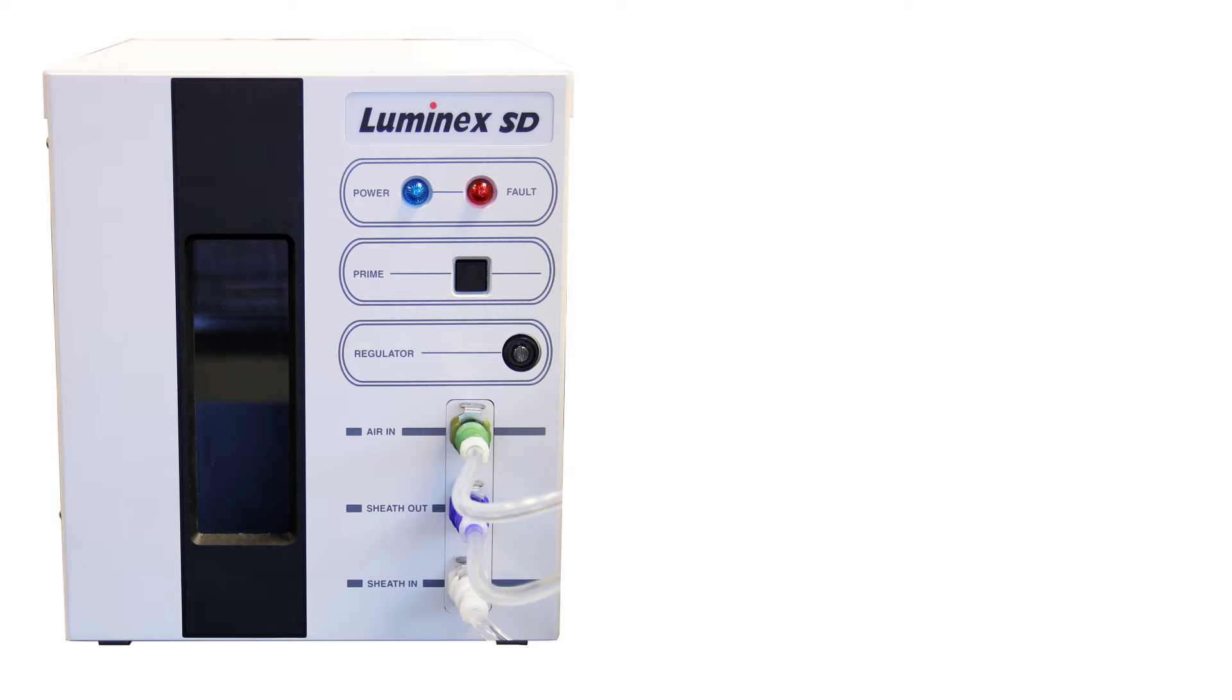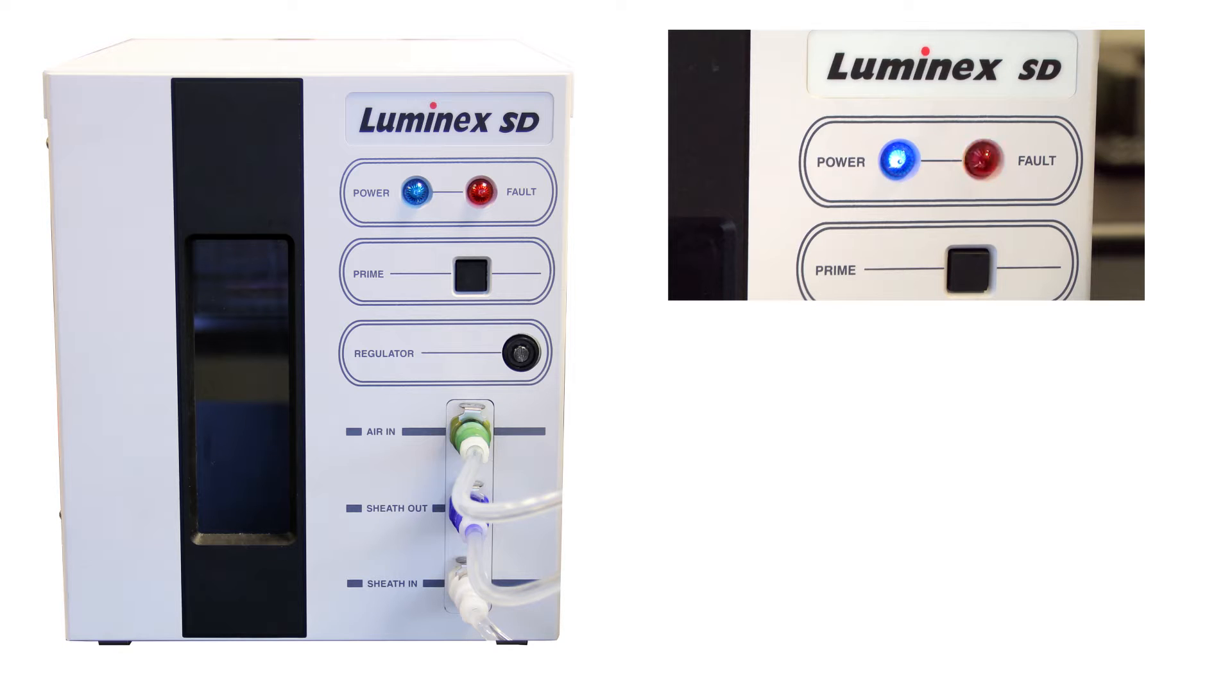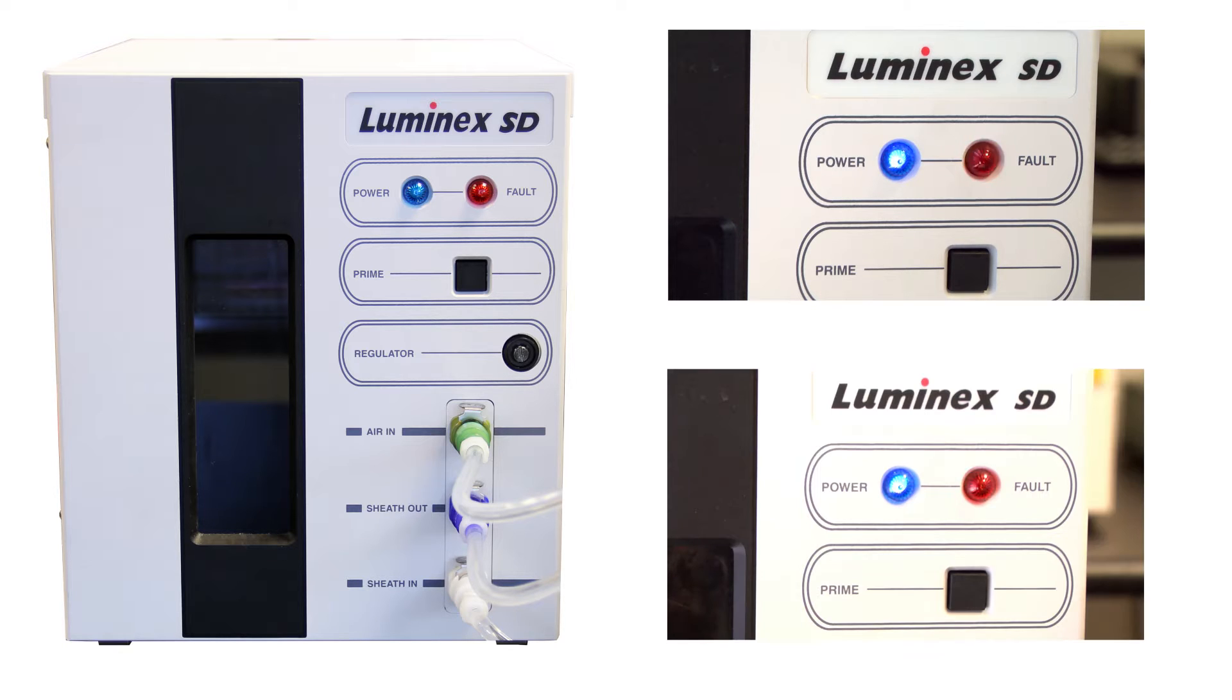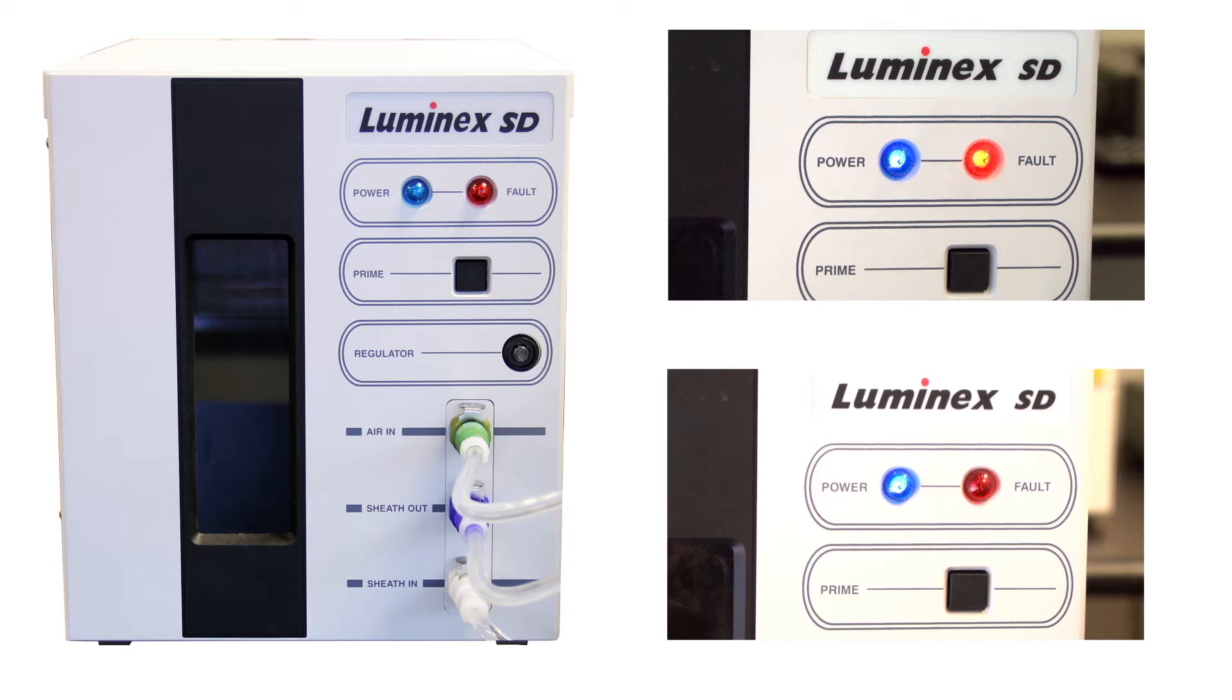The Luminix Sheath Delivery System has an audible alarm that sounds to indicate an issue. The alarm can beep quickly or slowly. The red fault LED light on the front panel flashes as the alarm sounds.